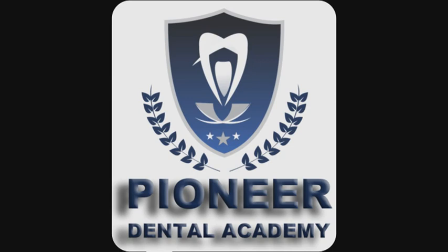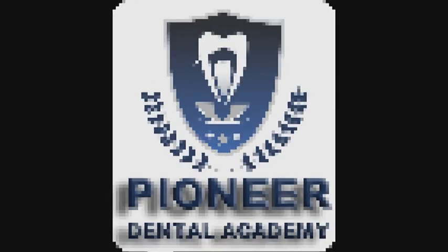It's not on the head. That's the problem. So for a machine more than 70 kVp, it is 2.5 mm. For a machine less than 70 kVp, it is 1.5 mm.